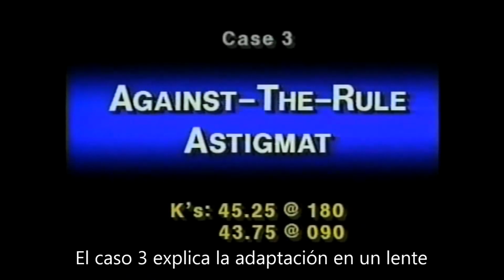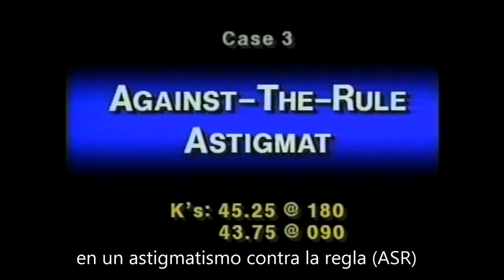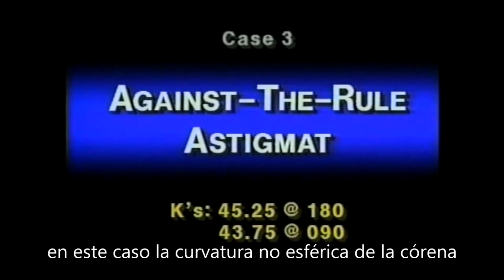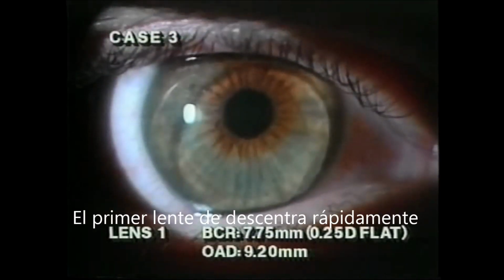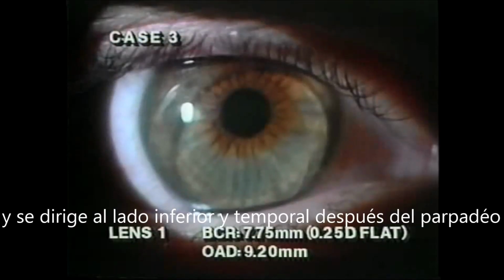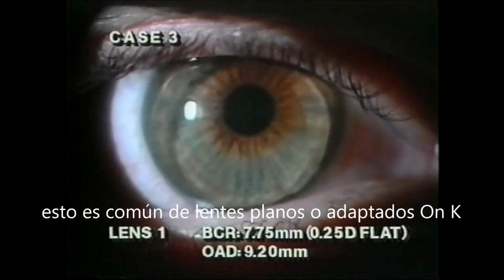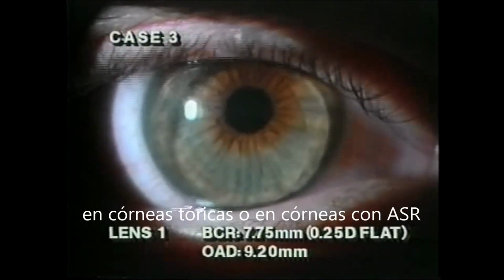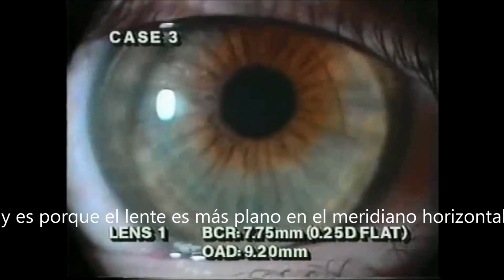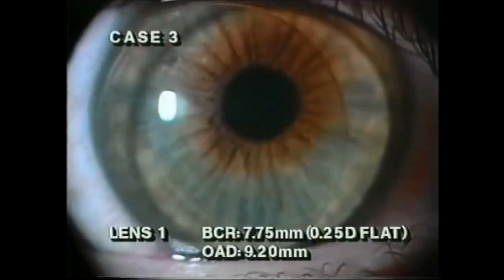Case number 3 involves the application of rigid lens designs on the against the rule astigmat. Spherical base curve radii will be compared to the aspheric design. Our first lens quickly decenters nasally, then inferior temporally with the blink. The lateral shift is characteristic of a flat or on-K base curve radius on a moderate against the rule astigmat. The lens tends to follow the contour of the steeper horizontal corneal meridian.